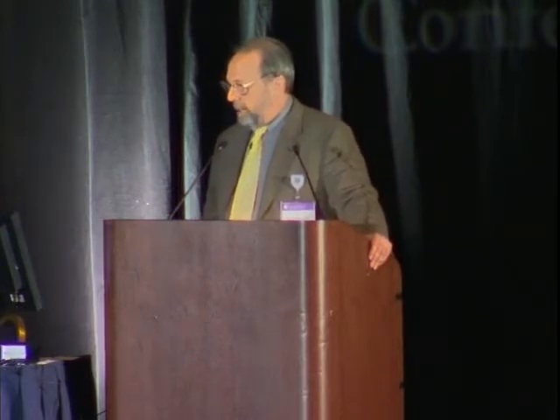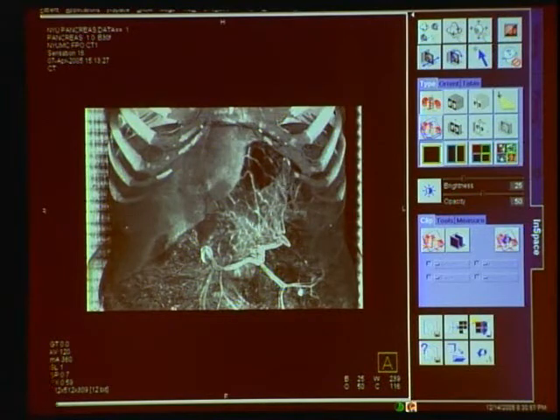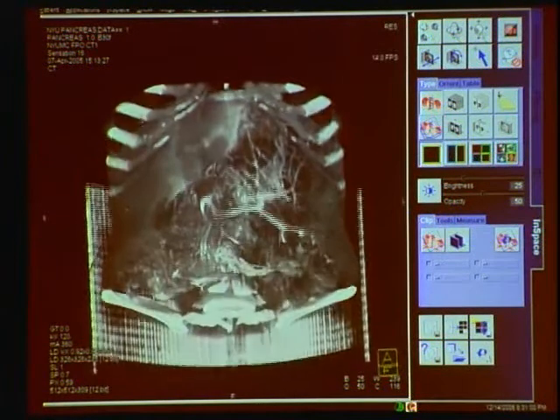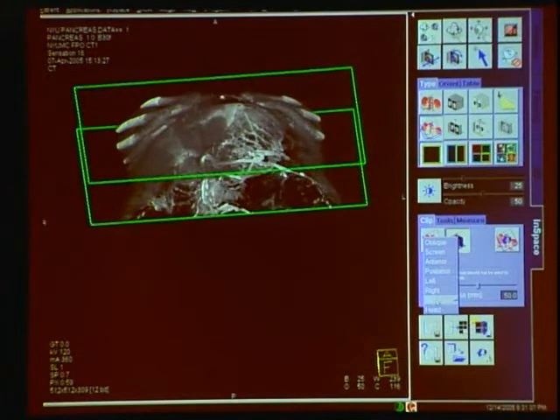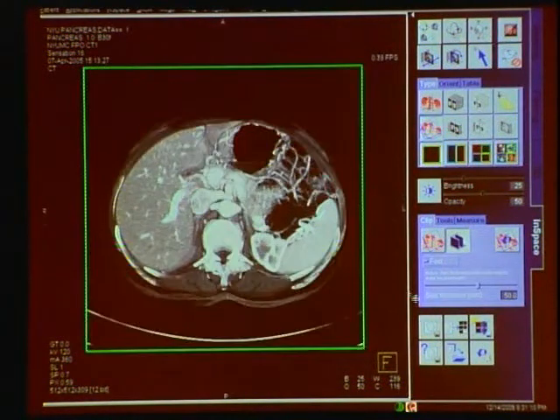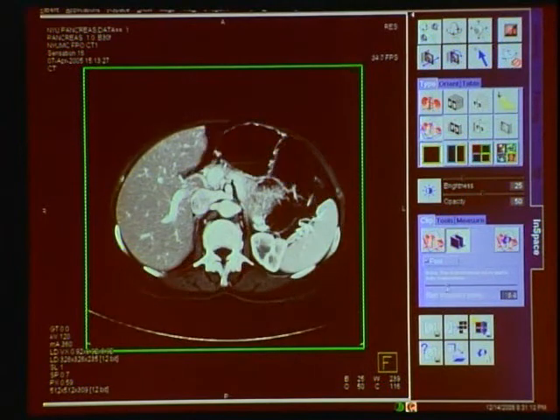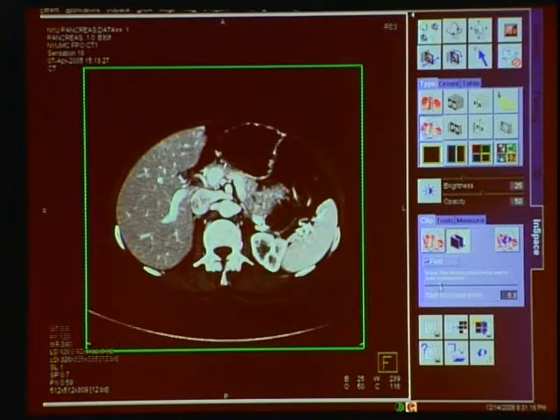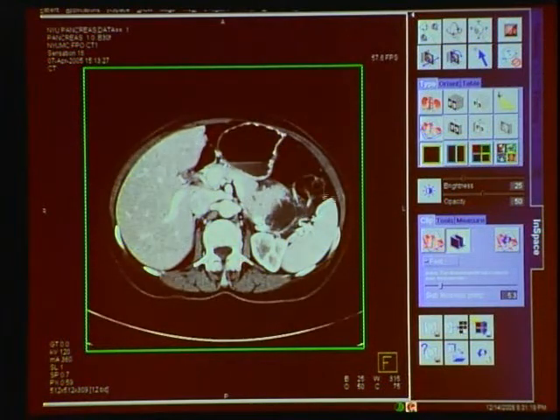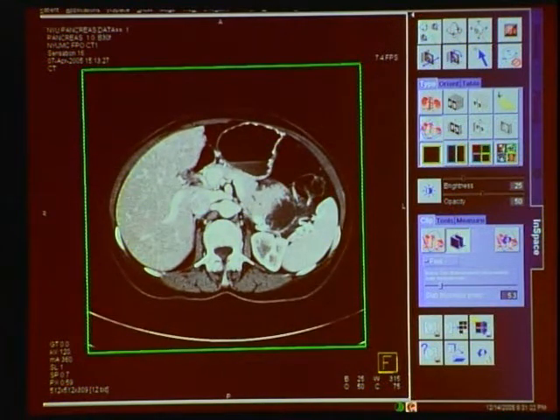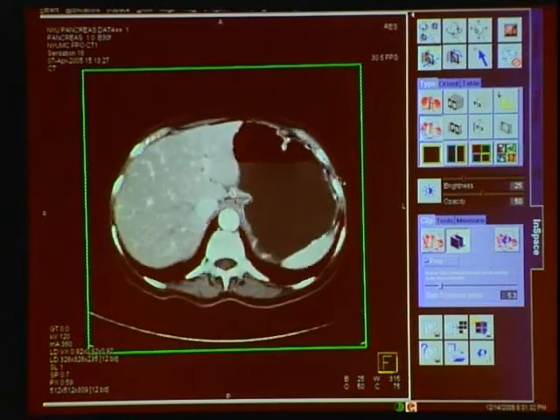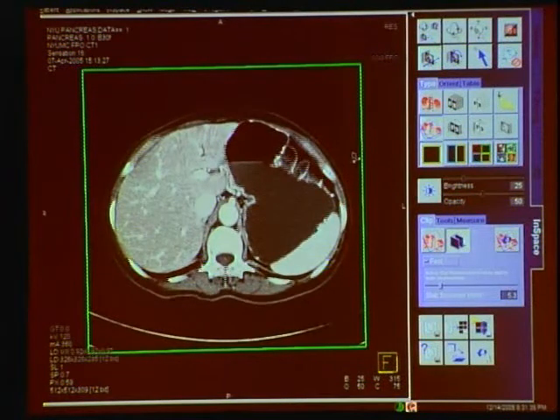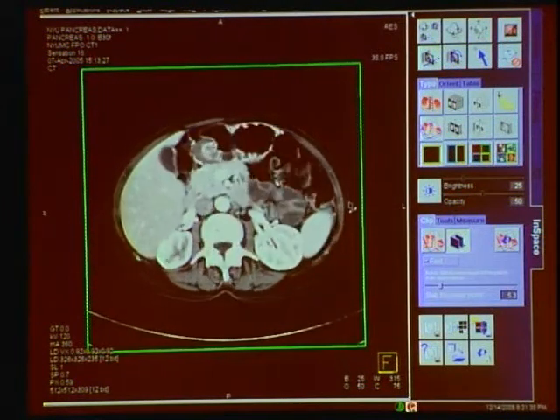The way this comes down is automatically into a coronal plane. We can take this whole data set and rotate it. We can apply clip planes, clip it parallel to the feet, align the data, and create — moving that slice thickness down to about 5 millimeters — window it optimally. And then we can just sort of scroll through the data set and look at it in a very similar way to our traditional axial images. 512 by 512 image quality. The image quality is good, yet we're still looking at this in 3D.